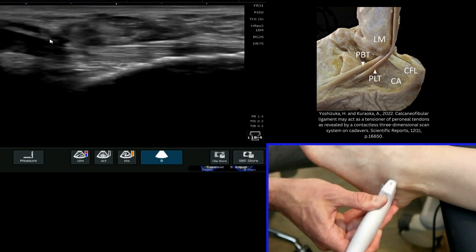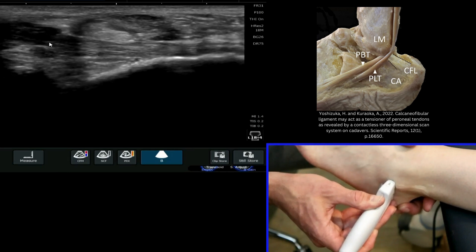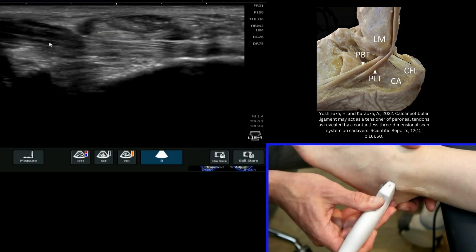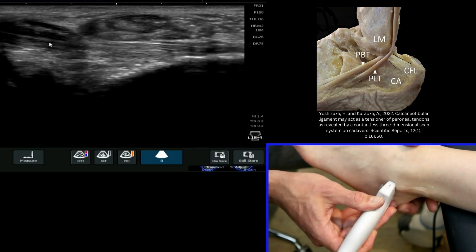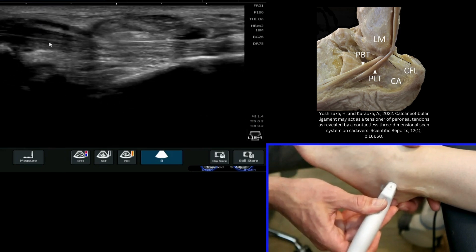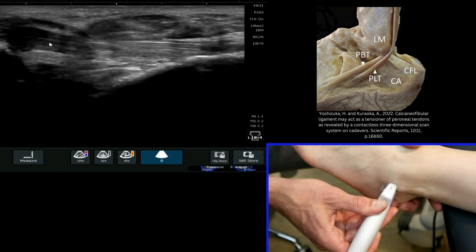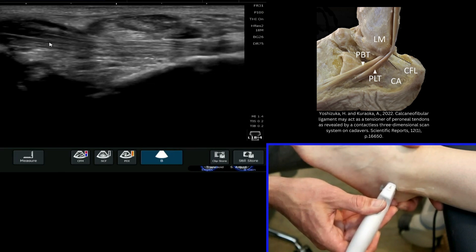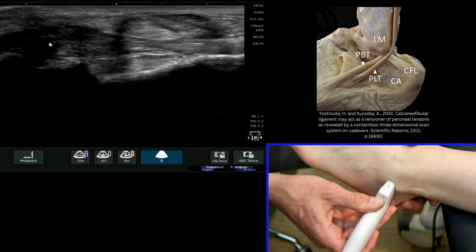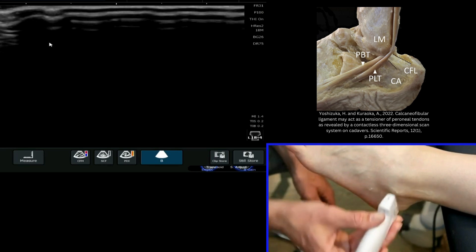I can tell whether it's intact through dynamic evaluation. If I gently just talar tilt or adduct the rear foot, you can see that I can tilt the ankle and tighten up the calcaneo-fibular ligament very nicely. The peroneal tendons just bounce on top of it, similar to a hammock. It's a very small movement with my other hand, just to tension up the calcaneo-fibular ligament.